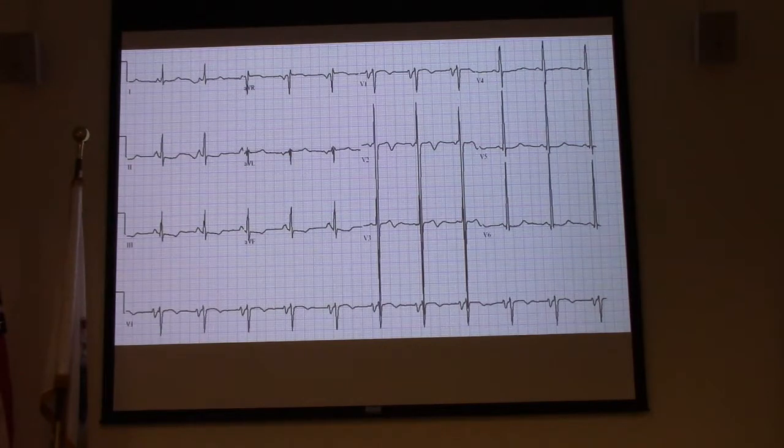If we look here, and I say, okay, V1 and V2, which one's got the deeper S wave? I can pretty much say that V2 has the deeper S wave. I go to V5 and V6 and ask which one's got the taller R waves, and I would probably go with V6. I count all the boxes and add them together, they total over 35.